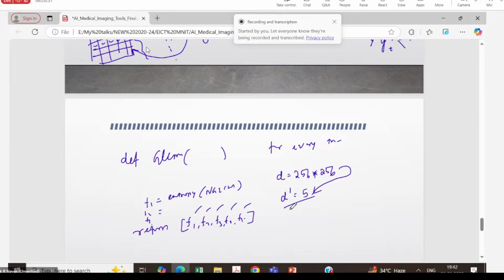And if you can represent the image using these 5 features, then why do we need this many features or this many pixels to process directly? I hope you at least got my idea of why we need feature extraction. Then there is the question of why these are handcrafted, why apply GLCM and not other algorithms. That is another question, which feature extraction algorithm should be adopted to give us better features, and we are not focusing on that.